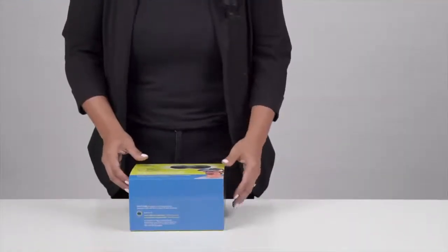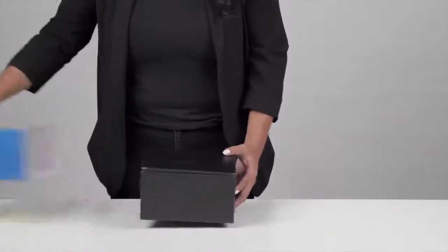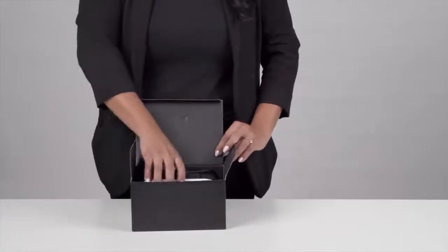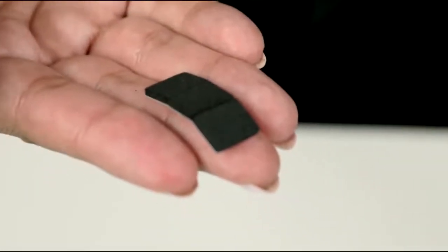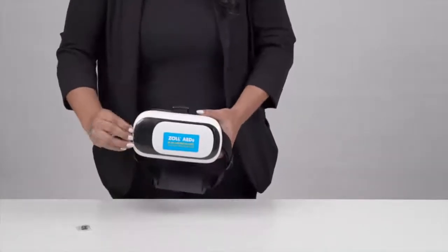The next step is to prepare your goggles. Remove the goggles from the box by sliding off the sleeve, opening the box, and removing the goggles. Next, locate the small plastic bag containing small black adhesive spacers. Then, remove the phone cradle by sliding it out of the side of the goggles.